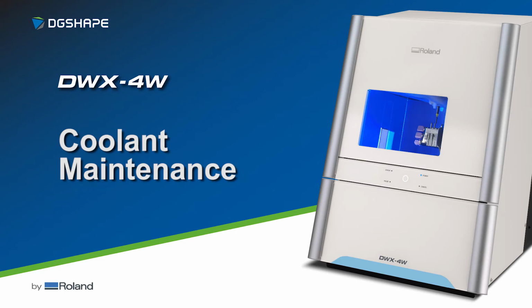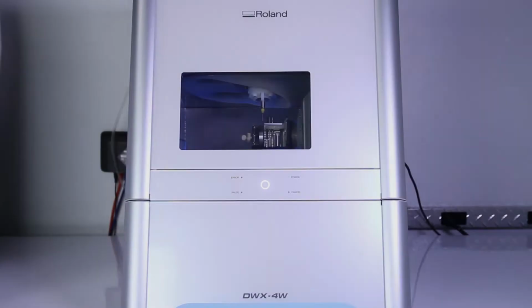Coolant replacement should be performed every week or every 15 hours when using the DWX-4W wet mill. It is important to be sure the coolant mixture has the proper ratio of distilled water, coolant additive, and chelating agent every time the tank is refilled. This video will walk you through the necessary steps to change the coolant for the DWX-4W wet mill.